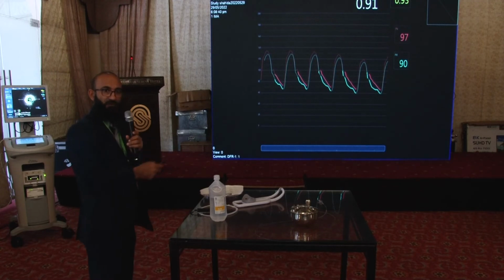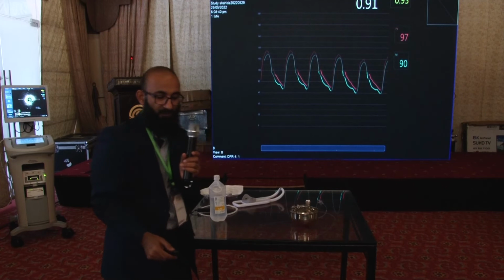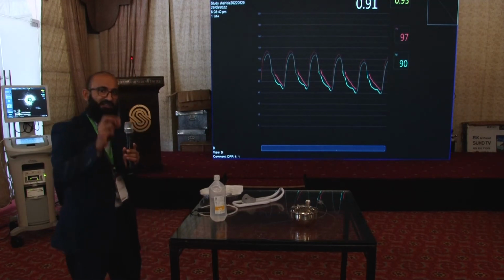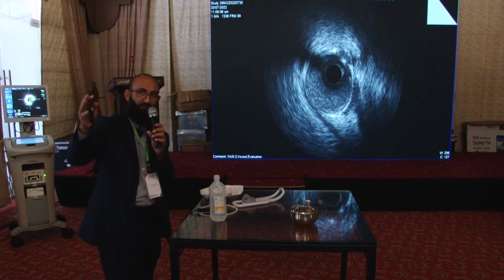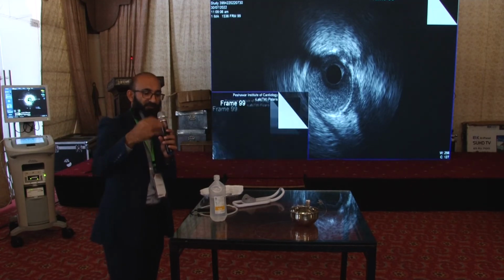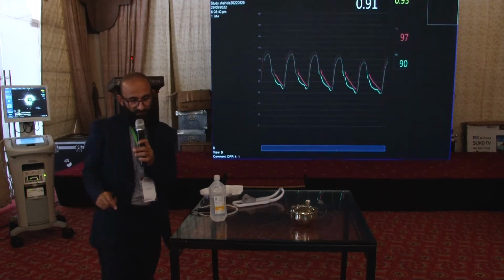It was normal. Perfectly normal. She was referred by another surgeon and cardiologist for a CABG. But the surgeon had a reservation, and he referred her back, and she was referred to us for further testing. Not this one, show that picture, these ones.